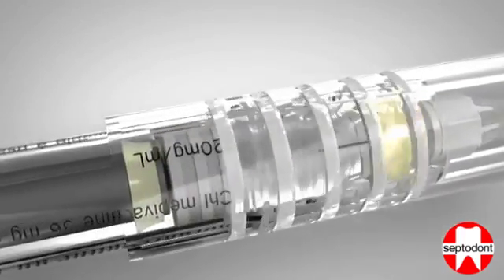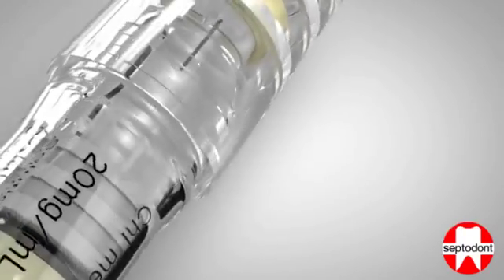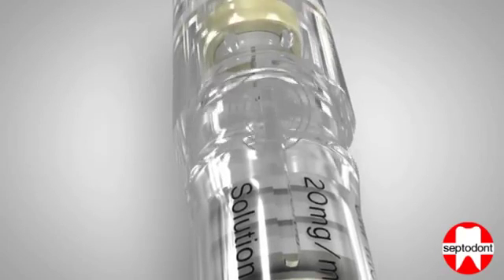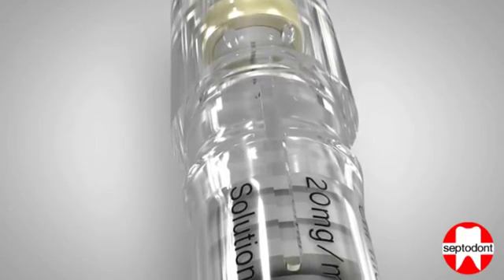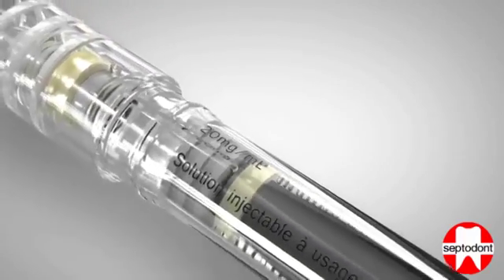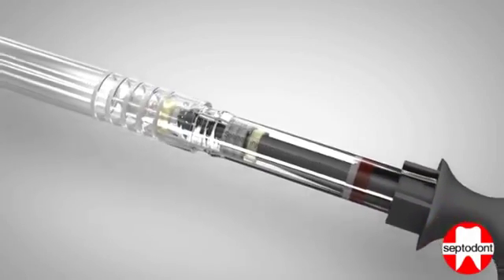Slide the protective sheath down the barrel of the syringe until you reach the first holding position. Then grip the barrel of the syringe and push the protective sheath firmly until a positive click is felt and heard. The device is now in the final locking position.